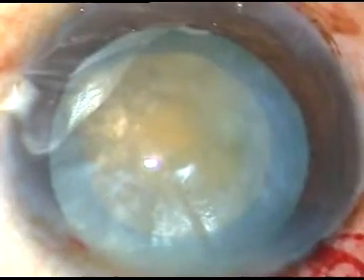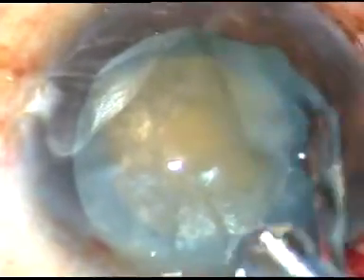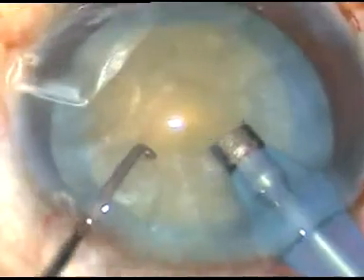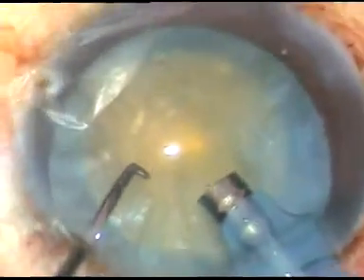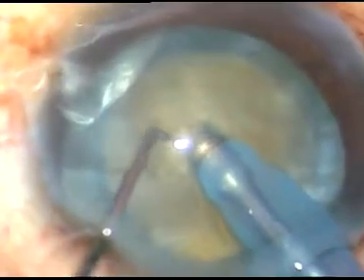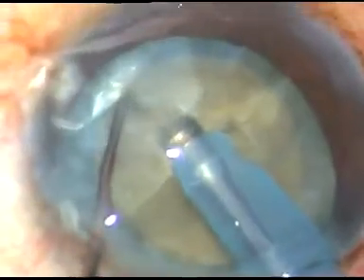Now is the time to enter into the eye with the tip of the phaco handpiece. The tip is introduced and I am going to do direct chop. The tip is buried into the substance of the nucleus. The nucleus is held very firmly and the nucleus is chopped.